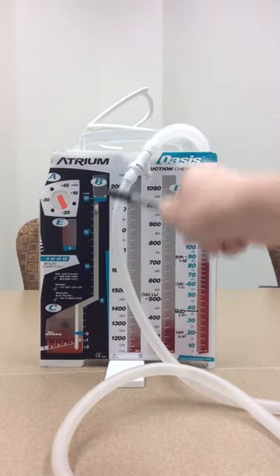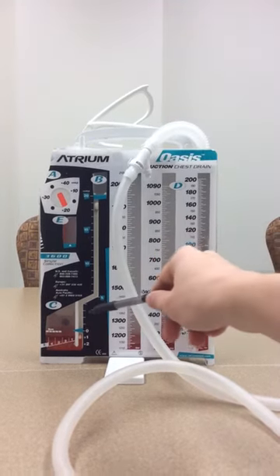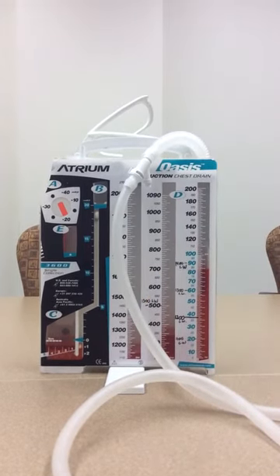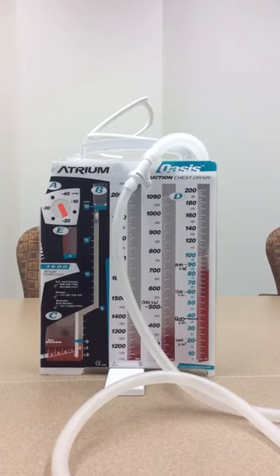B is your water seal, and C is your air leak monitor. This lets you know if there's a compromised system where there's either continuous bubbling, intermittent bubbling, or no bubbling at all.